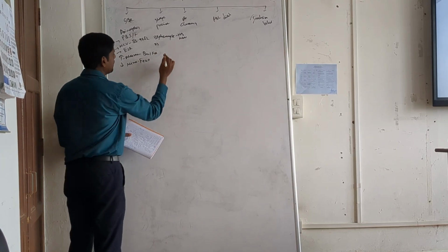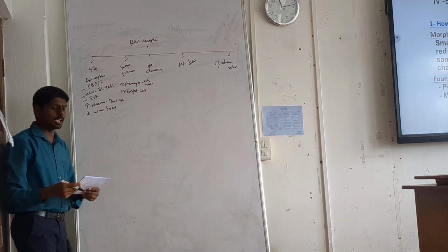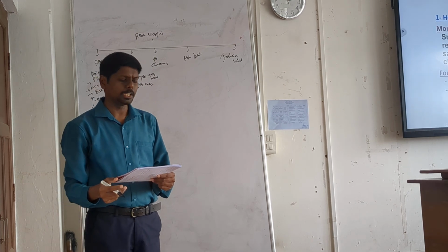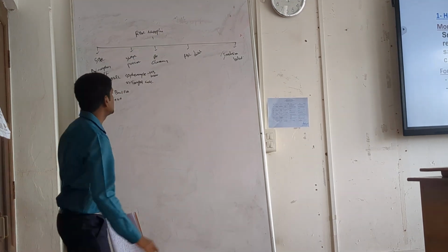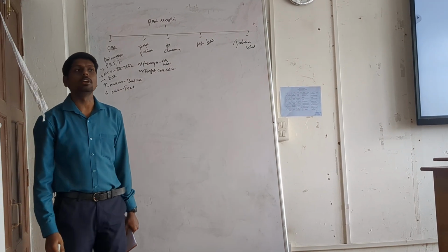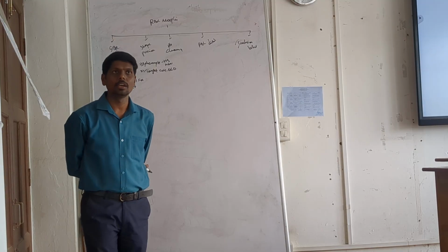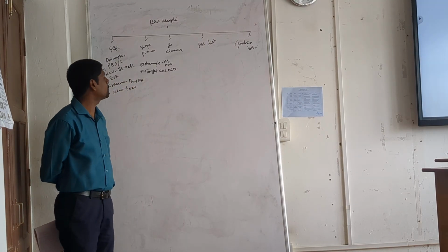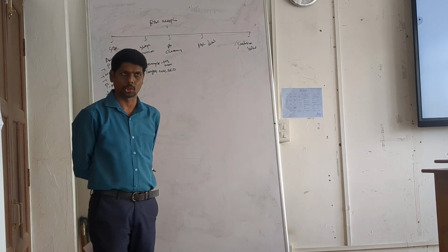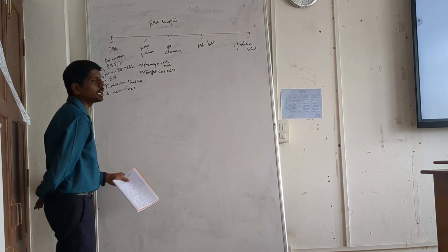Then second one we discussed was target cells, right? What is the primary cause of target cells? Liver diseases, obstructive liver diseases. Particularly obstructive liver diseases and hemolytic conditions. During excessive hemolysis and obstructive liver disorders, we have this. I also gave you the example of gallbladder stones, right? So with gallstones, in such conditions we can see target cells.